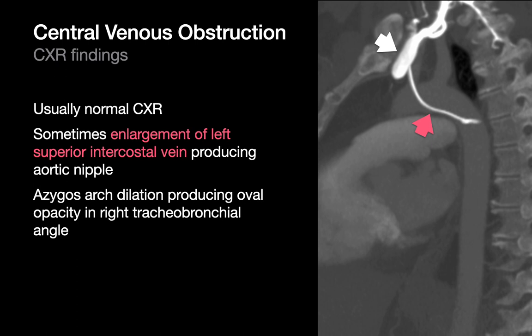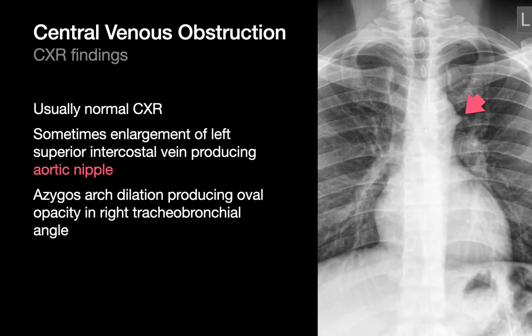One example is the left superior intercostal vein, which is a tributary of the left brachiocephalic vein. I've got a white arrow pointing at the left brachiocephalic vein and a pink arrow pointing at the left superior intercostal vein. The left superior intercostal vein is normal in this image, but in central venous obstruction it can become dilated. Since it parallels the lateral margin of the aortic arch, you may see a bump along the lateral margin — people refer to this as the aortic nipple.